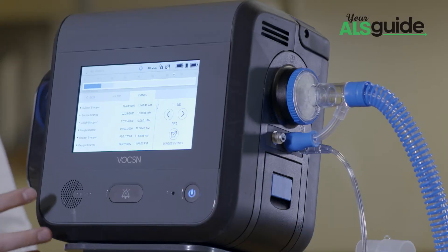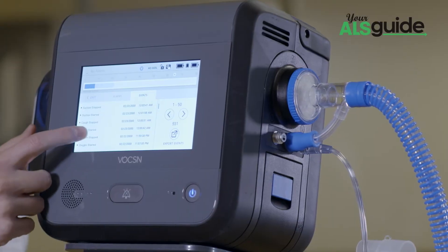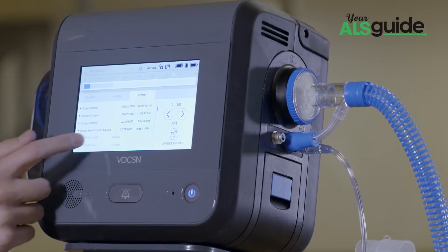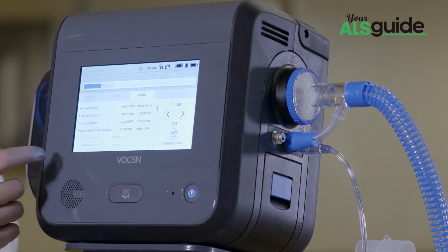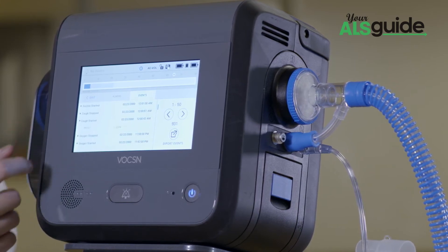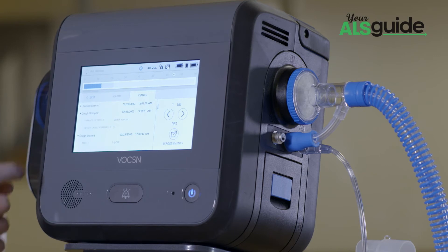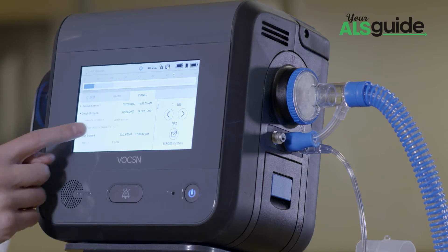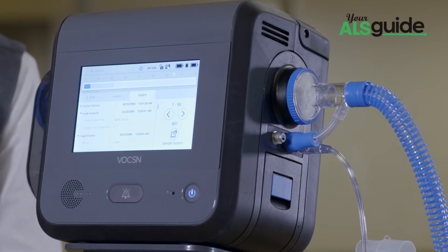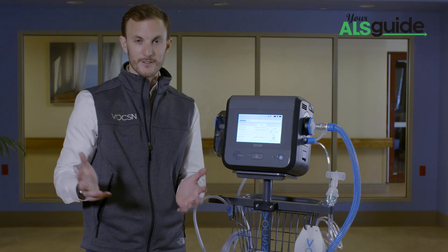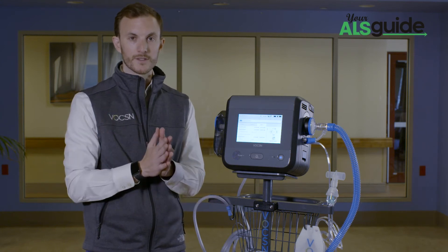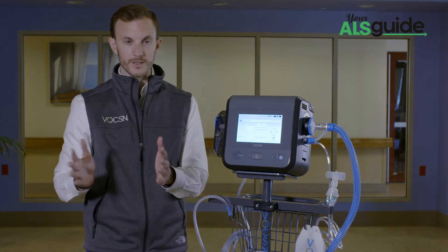I could walk right up to this patient and see that we changed our breath rate from 10 to 12, that we started and stopped oxygen, that we did a cough therapy — a low cough — and we did three cough cycles that lasted a grand total of nine seconds, as opposed to the 15 minutes that one cough therapy might have taken with traditional devices.